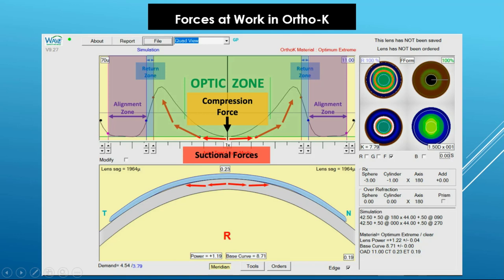The optic zone diameter and the base curve combine with the return zone to help create the amount of topo demand and epithelial displacement that can occur. The smaller the optic zone, the flatter the base curve, and the higher the return zone, the greater the topo demand that can be created and the greater the amount of refractive error that can be corrected.